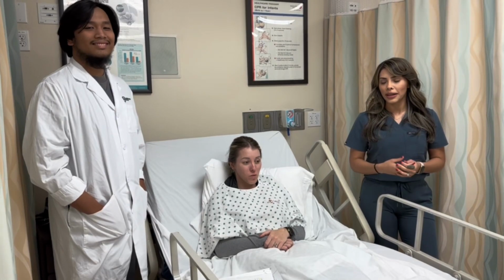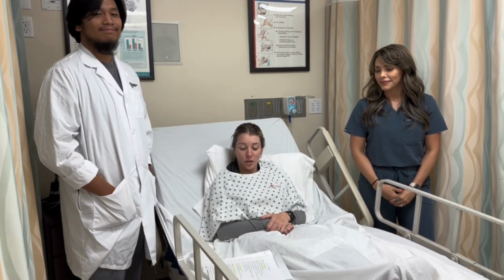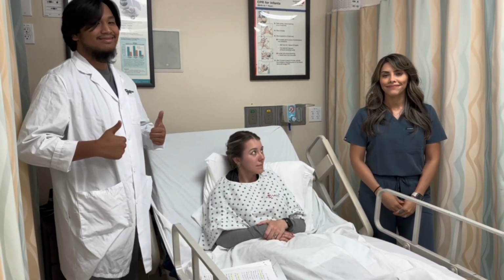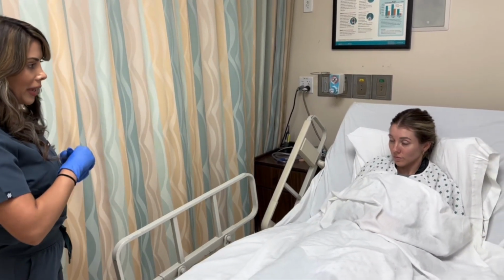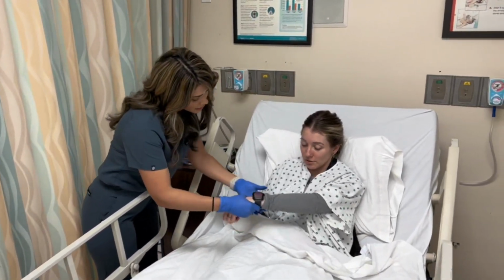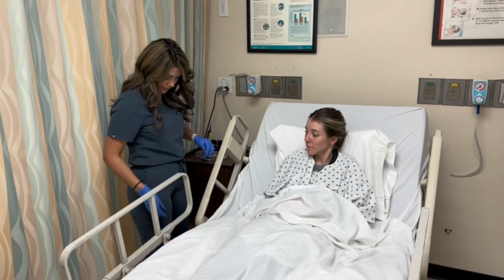Hi, my name is Maria. I'm Kasey. We're going to be going over a non-rebreather and a partial rebreather. They're going to be demonstrating on me. Hi, my name is Maria, and I will be your respiratory therapist today. I washed on the way in, and I gloved on the way in. What is your name and your birthday? Kasey St. John, 12/4/93. And the physician actually ordered for a non-rebreathing mask.